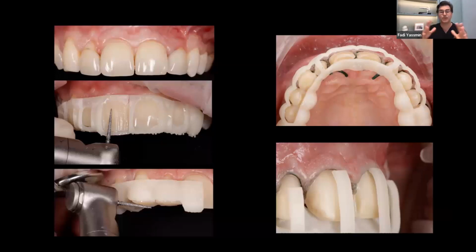If you're missing teeth, you're able to put in the ideal space. If you're looking at restoring teeth, you can line them up beforehand. If you're looking at aesthetics, you will align beforehand. I've even aligned cases after I've done the restorative. So it really is important. And for me, it's a big part of my assessments and protocols.